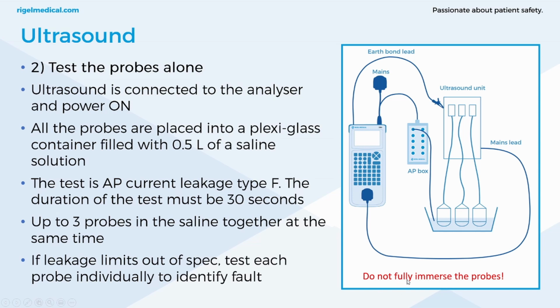One thing to note is just to not immerse the probes fully. We're just immersing the probes to a point where we think there will be patient or user contact. It's always important that you don't submerge these fully. Okay, so the duration of the test must be 30 seconds, and that ensures that any saline gets a good contact between our electrode here and any ingresses that you might find within the ultrasound transducer.